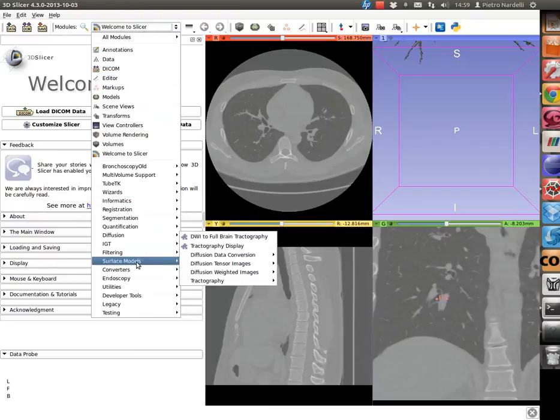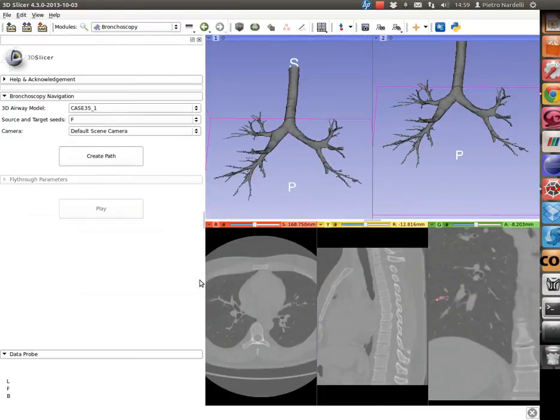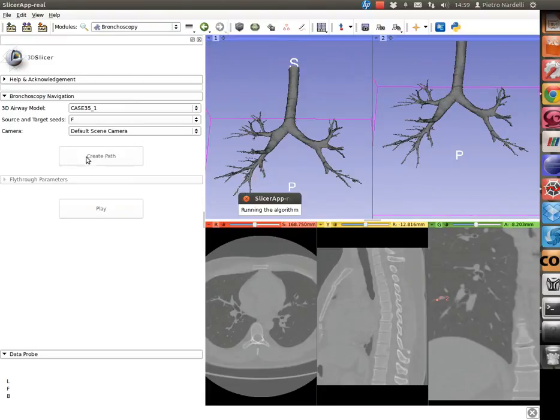At this point, look for the bronchoscopy module in the module selection menu. Once the module is open, two 3D views are shown and the 3D models are automatically centered.